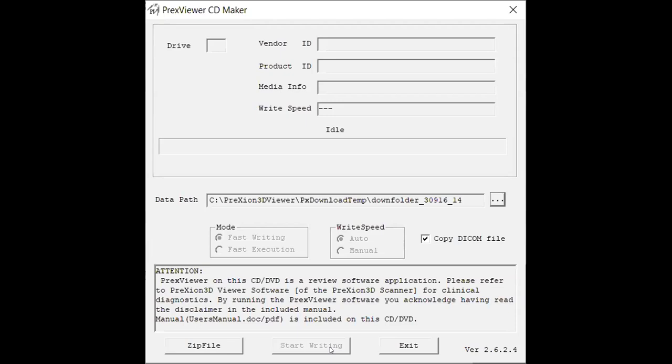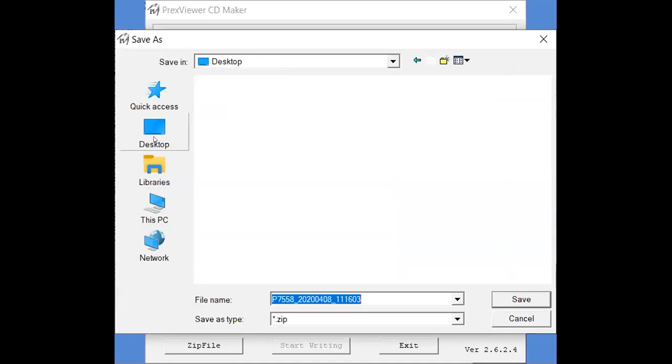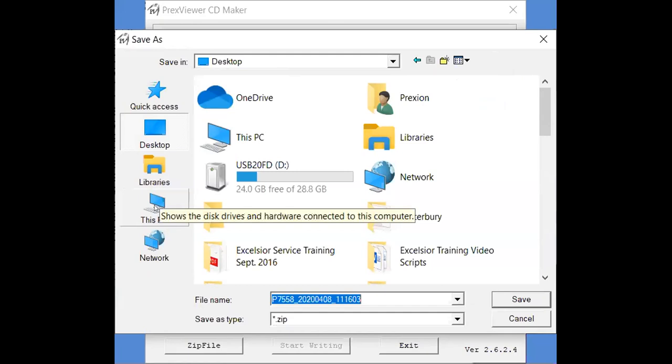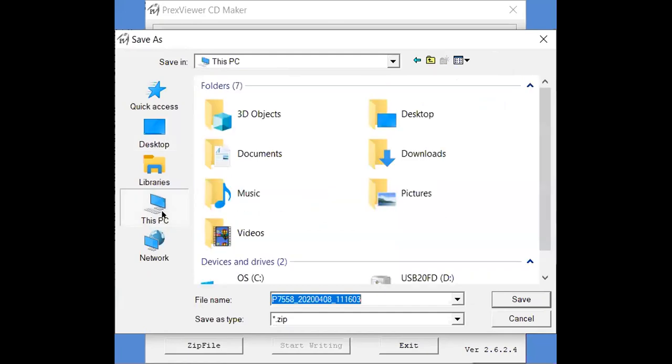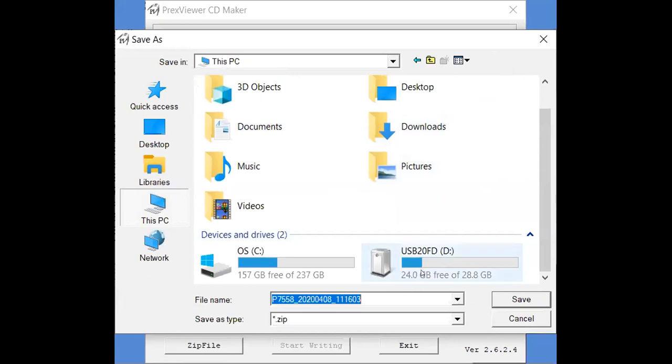Now if you prefer to save those files onto USB you'll want to select zip file instead. Once you do that you'll get a pop-up which will give you the option to save that file wherever you prefer. You could either save it on your desktop or you could save those files directly onto a USB by going to This PC and then finding your USB location.